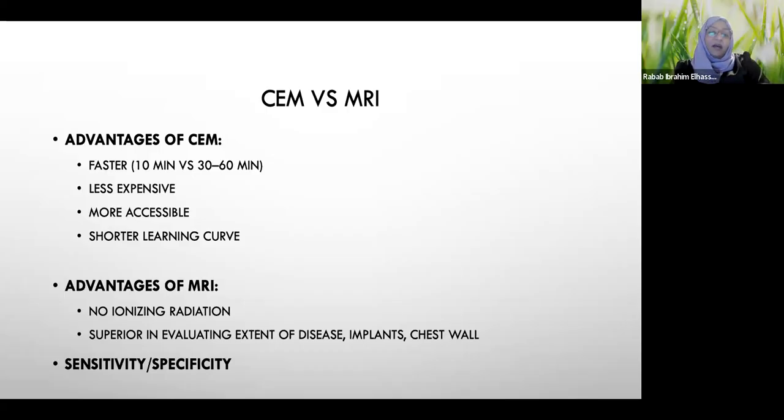It also has a shorter learning curve. When you already read mammograms, you have already done 50% of the job of learning how to report contrast enhanced mammograms. And if you used to report MRIs, again, you probably know 90% of the work. So it's much easier for trainees and radiologists to learn interpreting and reading contrast enhanced mammograms compared to reading MRI, for example.